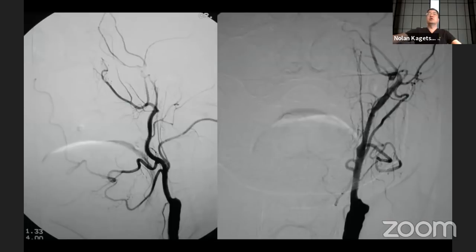So this is a kind of an anatomy review. One thing, to me, sometimes what you may see in medical school regarding blood vessels is almost a cartoon, and it's kind of interesting to actually see real anatomy and real people. And this was a patient that was probably getting worked up for a stroke or transient ischemic attack. So we did an injection of the carotid artery.